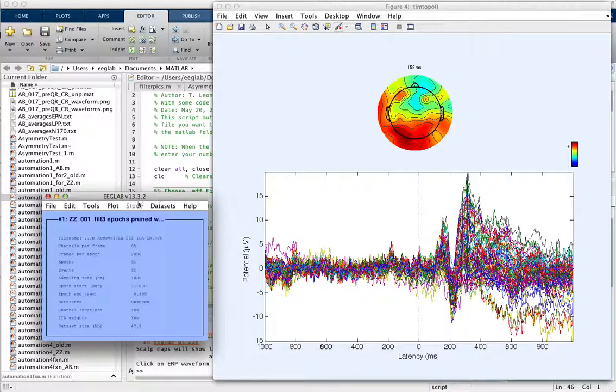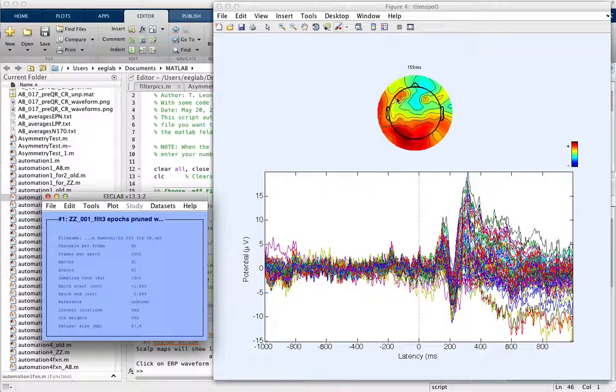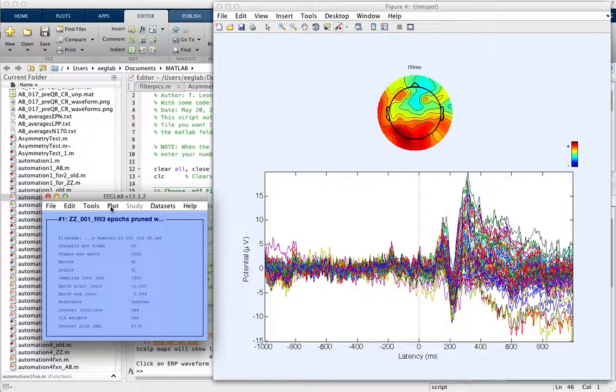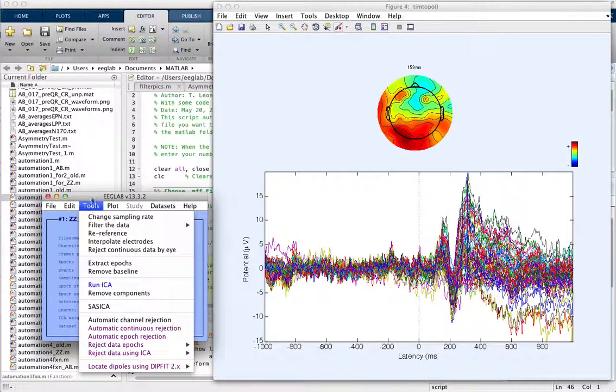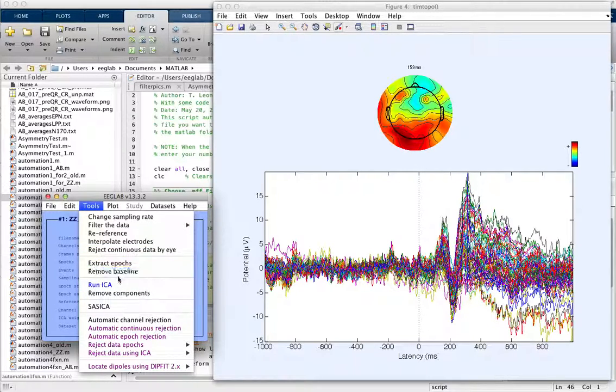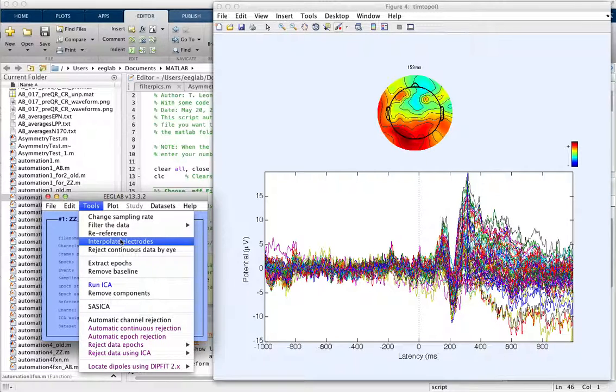First we need to know what these electrode numbers are. You can do that by comparing it to a channel map and seeing which electrodes they are. I know that they're 11 and 60, the numbers that we want to get rid of. So we're going to go to Tools, Interpolate Electrodes.